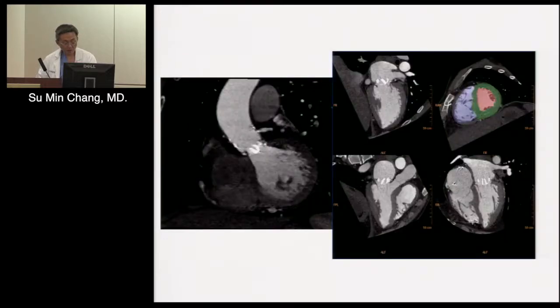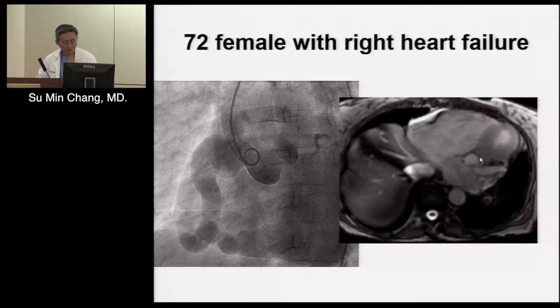And this is the function. Let me give you one example of what the 3D display can help with. This is a patient who presented with right heart failure. You can see an angiogram. There's something wrong with the right coronary.